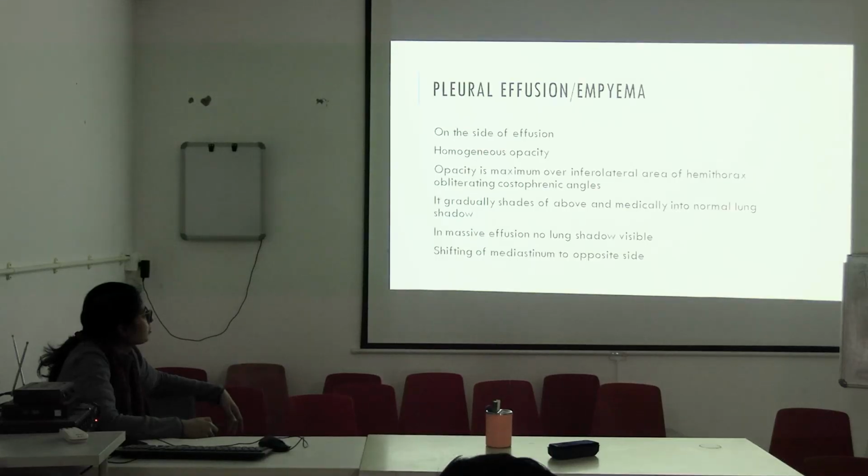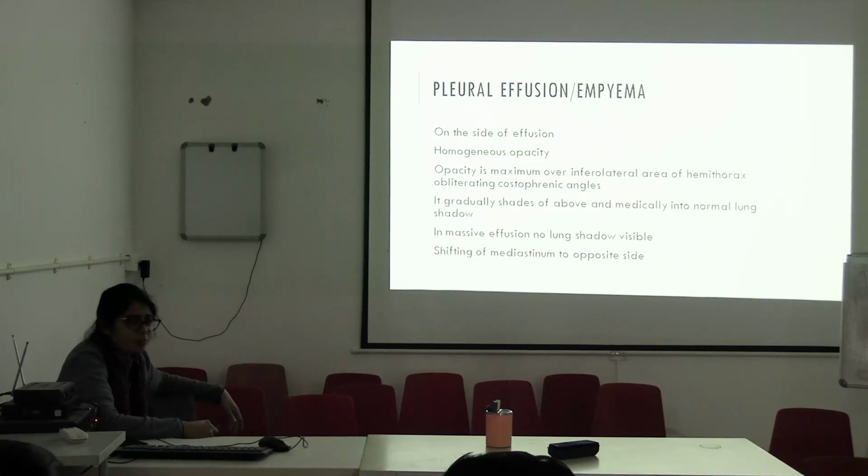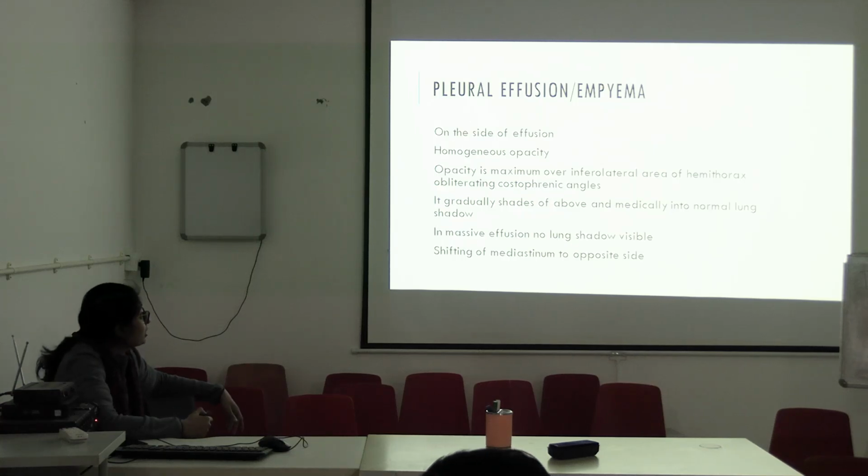Now we will talk about pleural effusion or empyema. Pleural effusion means what? Fluid collection in the pleural space. And what is empyema? There is pus collection in the pleural space or pleural cavity. So pleural effusion, on the side of the effusion again you will get homogeneous opacity.